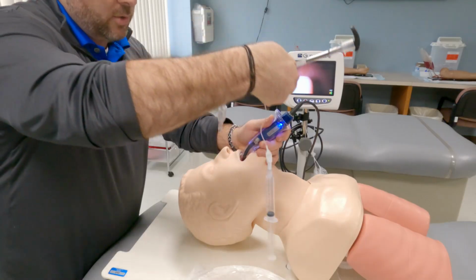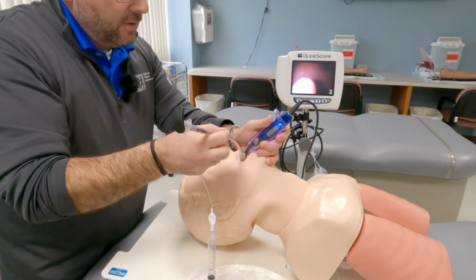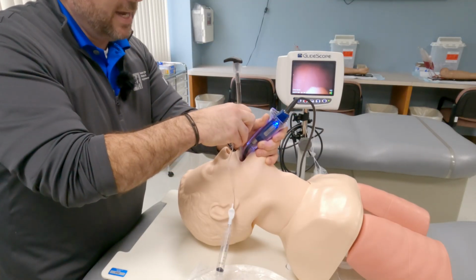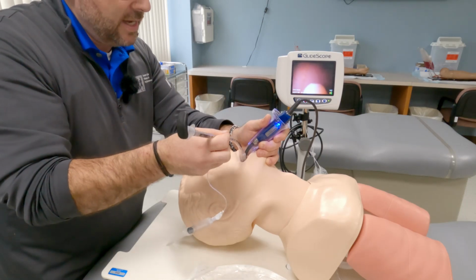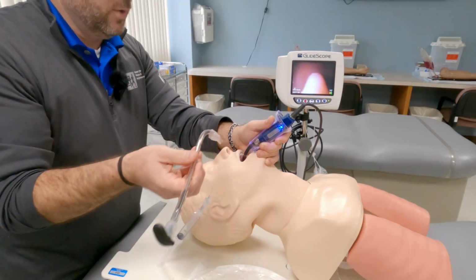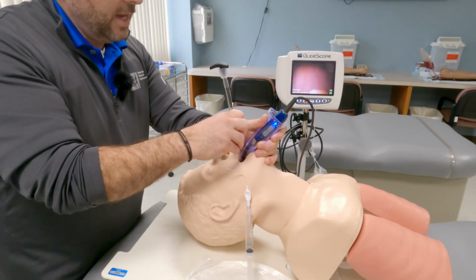Now that I have this in, I'm going to take my endotracheal tube and I'm going to go in at the angle like this. I'm not going like this. I'm not going like this. I'm going at a 90-degree angle. I'm going to go in, and then I'm going to rotate it up. So it goes like this, in and rotates up. And you're going to see that come into view in just a second. So 90-degree angle to the face, in and rotate up.